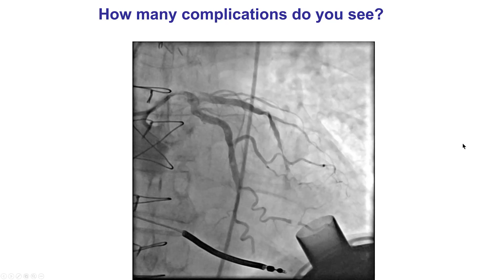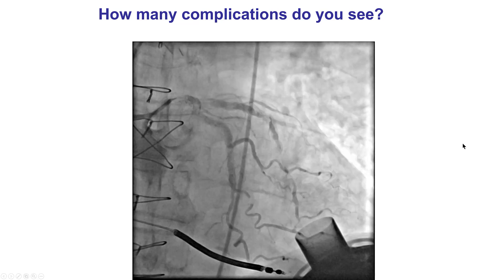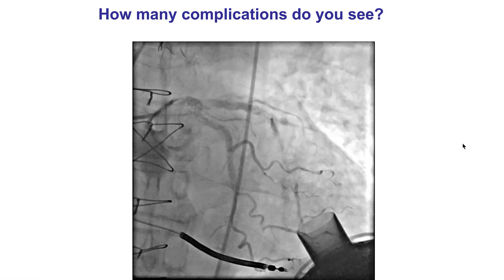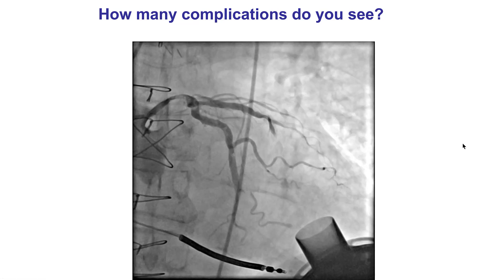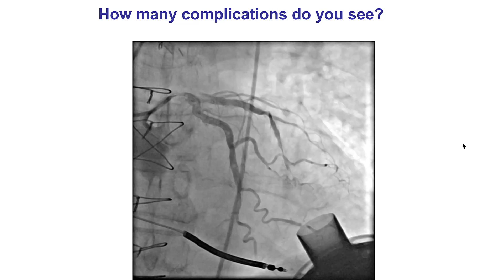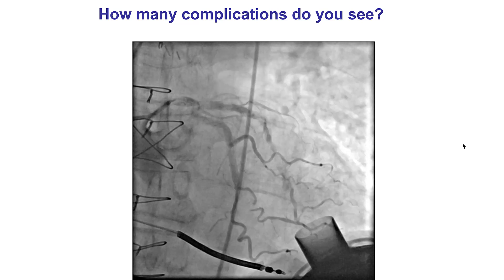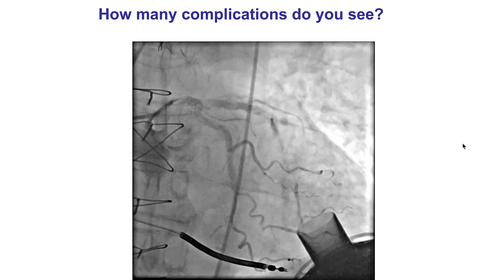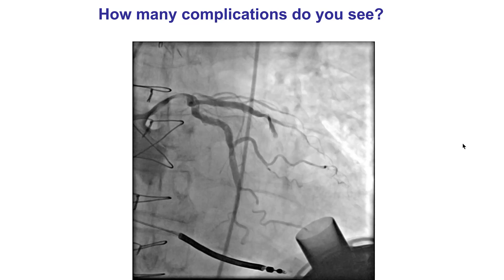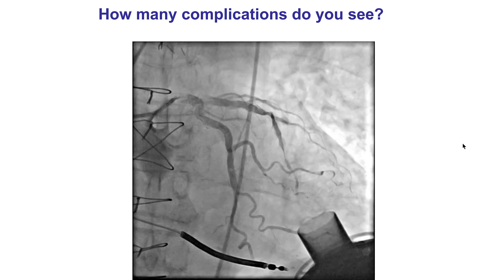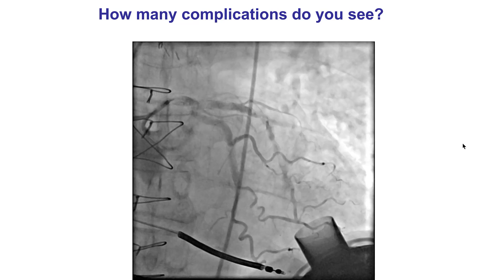This was the first injection of contrast into the left main coronary artery. The question is: how many complications do we see in this one injection? The answer is we see at least three complications.